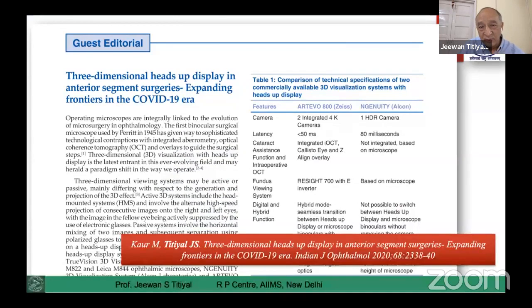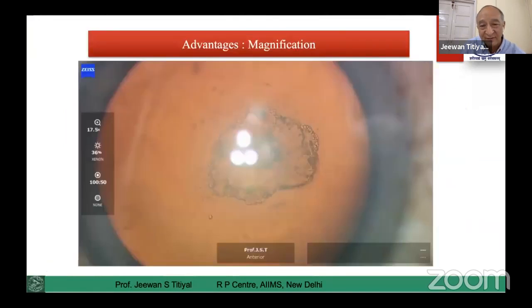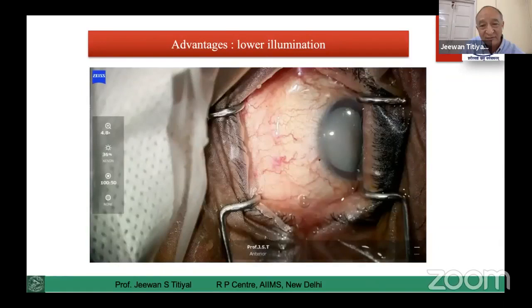And if you look into the various systems which are available, they all give you a good video output, high magnification like this. You can assess every point of concern for a cataract surgery. It can give you a digital assessment. It gives you OCT assessment, especially important for intumescent white cataracts. In case of post-polar cataracts, you can classify on table. You can modify your surgical steps on table.